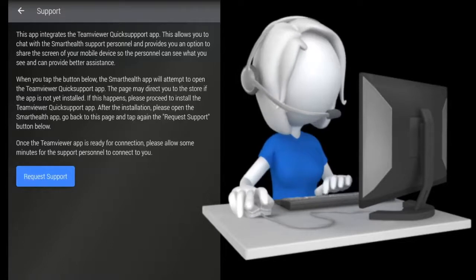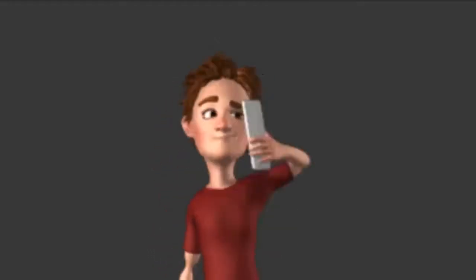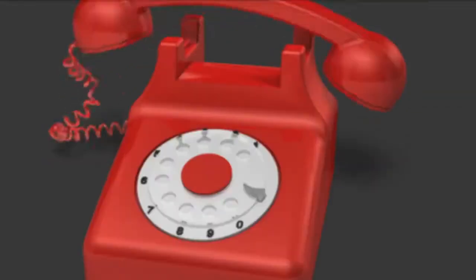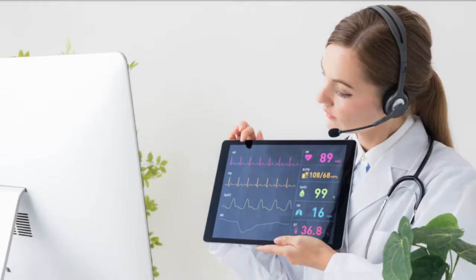It isn't necessary for the user to find these special features on their own. Included with each sale of Smarthealth1on1 home monitoring equipment is our welcome call to the user confirming that the product was delivered and helping the user with any questions. We will assist them through their first test and verify that the test results uploaded correctly. During this welcome call, we will show the user the special features that are offered so that they know that they are never alone. We also check and verify after 3 days that the user has uploaded their test results to the internet. If not, we communicate with the user to verify that the equipment is working correctly and that they are testing.